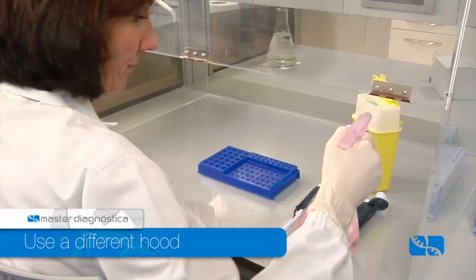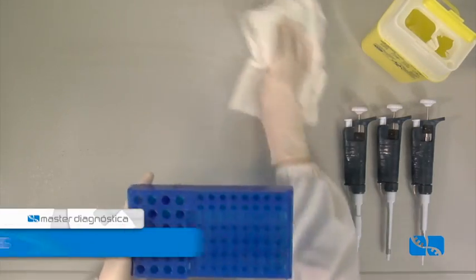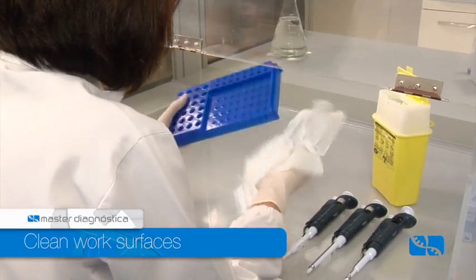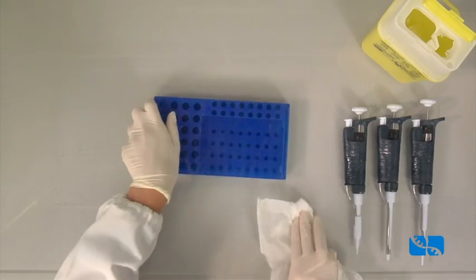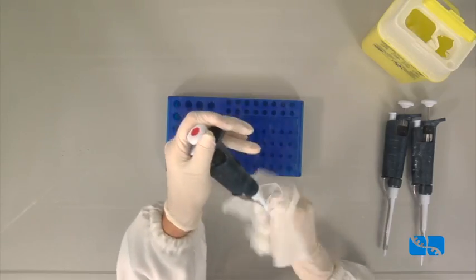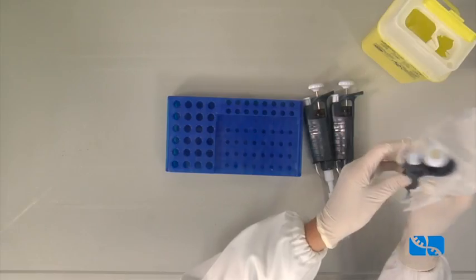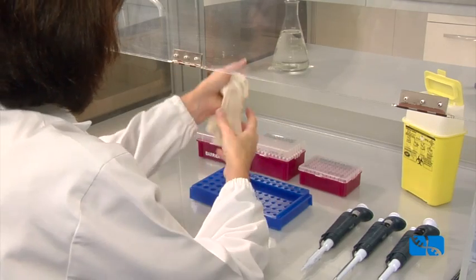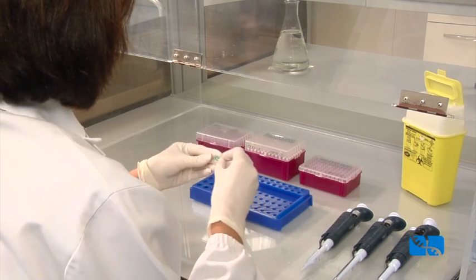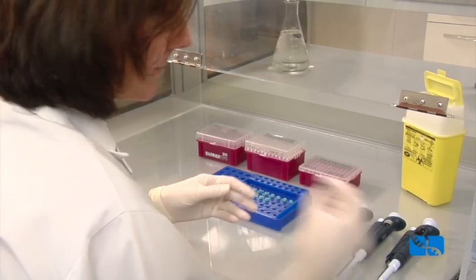PCR step must be done under a different hood from where samples have been prepared. Before starting with the PCR step, all work surfaces must be cleaned with diluted bleach or any other commercial reagent that destroys DNA. Any material, pipettes, racks, tips and so on to be used during the process must be cleaned too. Prepare PCR tubes on a rack. Reagents for PCR must be unfrozen.